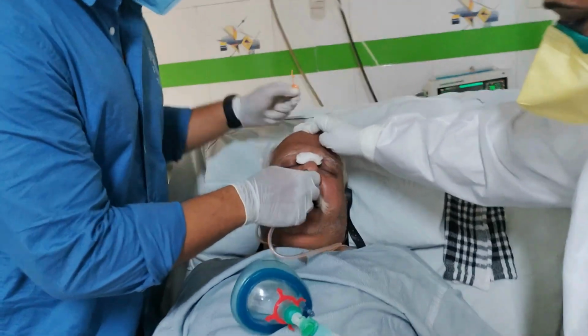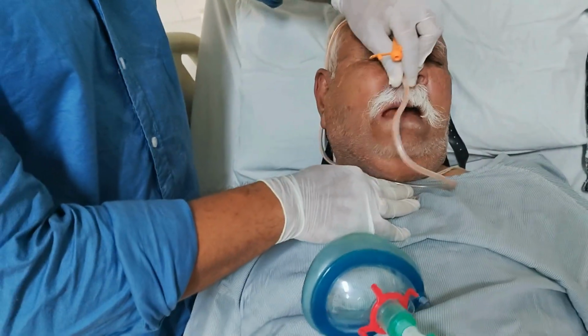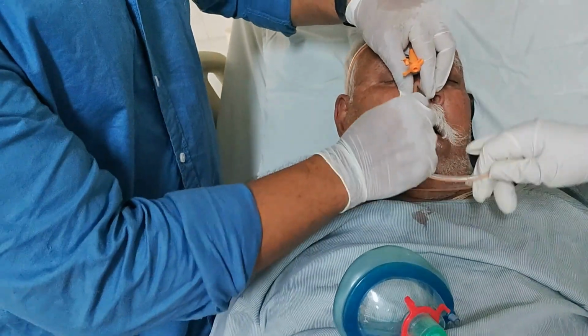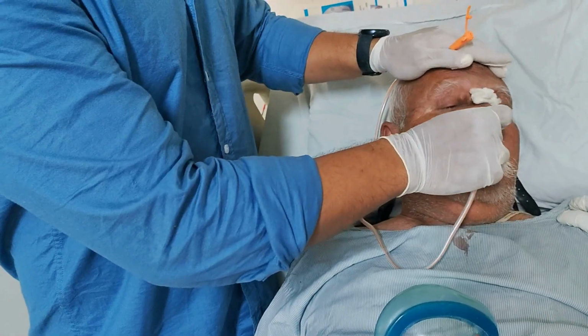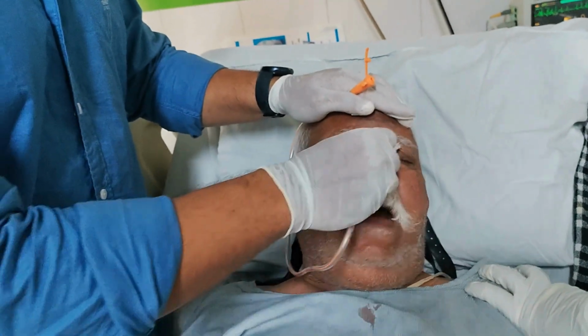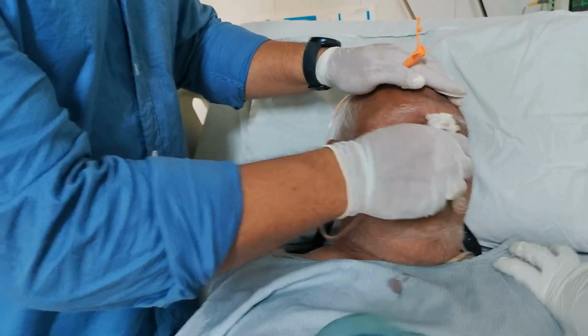If the patient is conscious and able, you can offer sips of water or ask them to swallow, which helps guide the tube into the esophagus. Keep going slowly and steadily without rushing. If the patient becomes too restless, have your assistant hold their head gently, keeping them as calm as possible. The goal is to avoid causing unnecessary discomfort or nasal trauma.